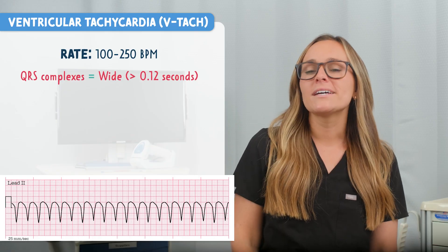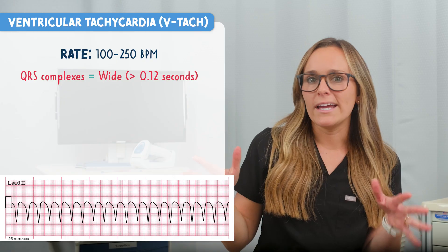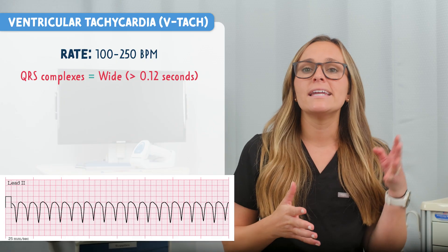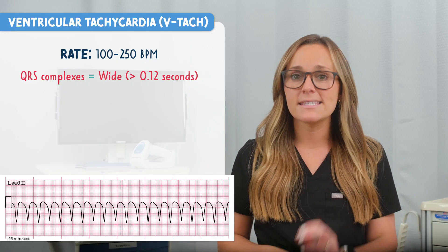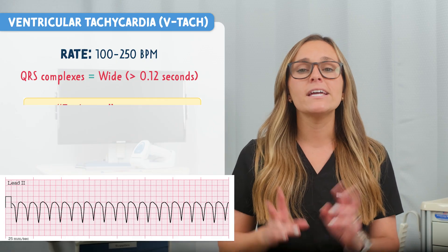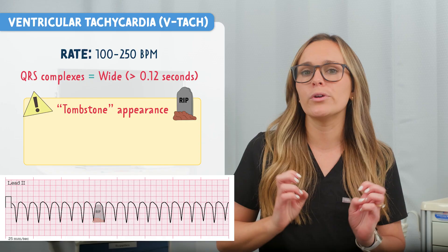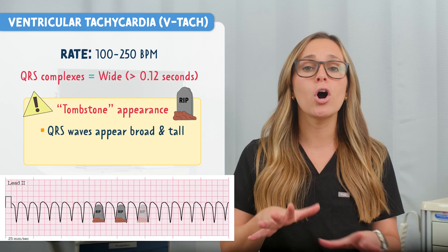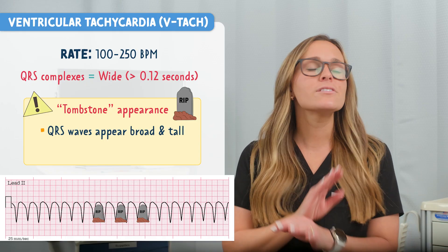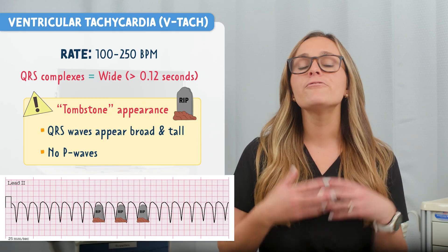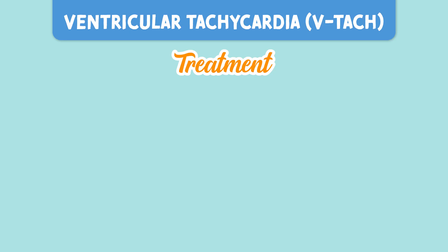The QRS complexes are wide — greater than 0.12 seconds — and they have a tombstone appearance: tall and broad. And there are no P waves.